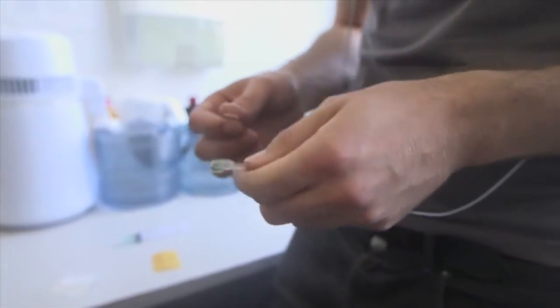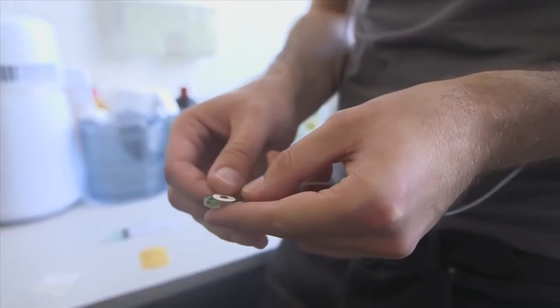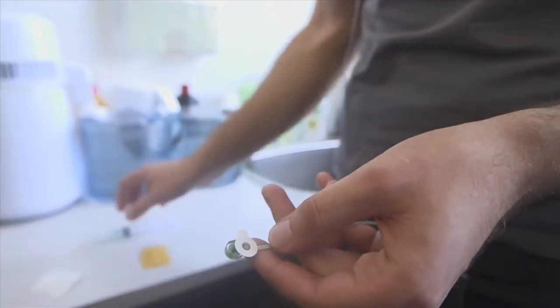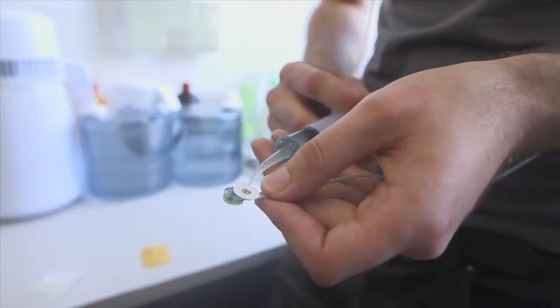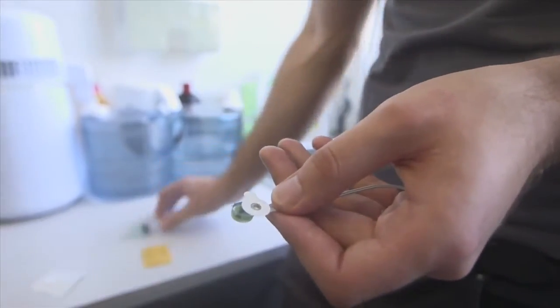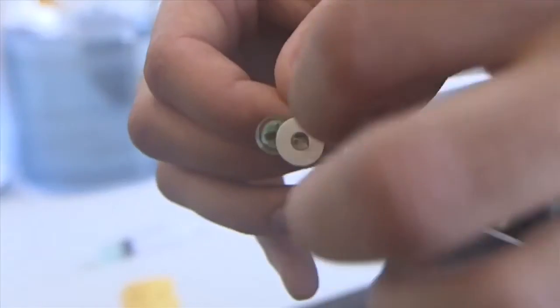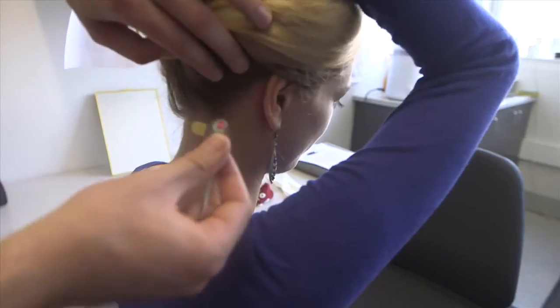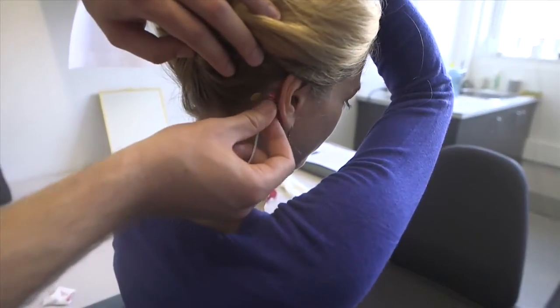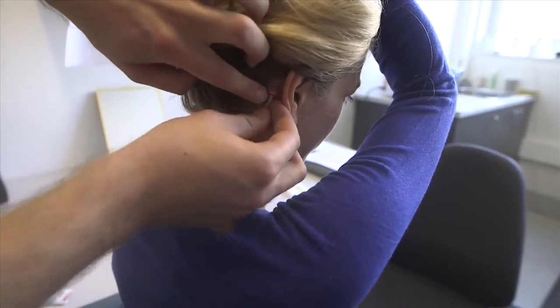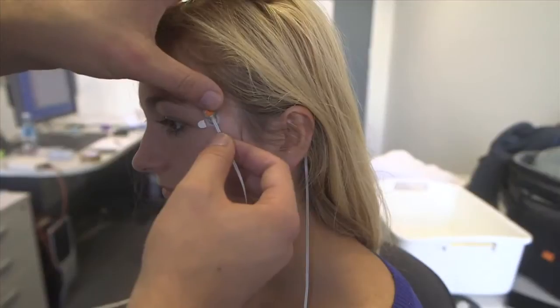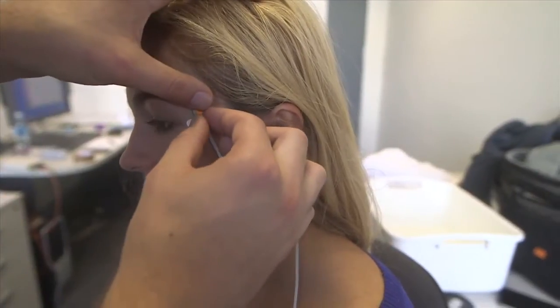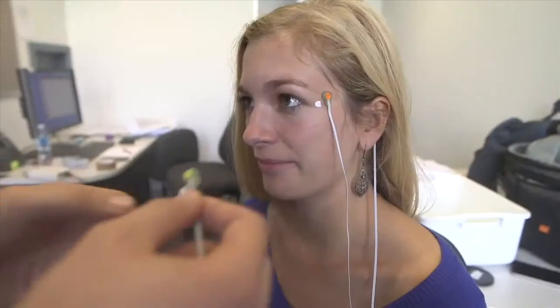Now, attach the adhesive rings to the external electrodes. Then, apply a small amount of conductive gel to the electrode and peel off the white covering. When attaching electrodes one and two, make sure that they're on top of the mastoid bone to minimize interference to these reference electrodes. Attach the third external electrode next to the participant's left eye, and the fourth one underneath the same eye.